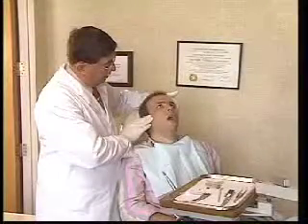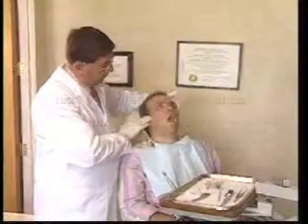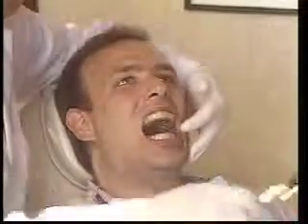Here are some common problems you and your patients may encounter and some suggestions on how to deal with them. If patients complain of sore temporomandibular joints, the cause may be too much advancement. The cure for this is to move the silencer back one hole at a time. The same complaint may also be caused by unbalanced bite pads. Check the pads and mill them if required.